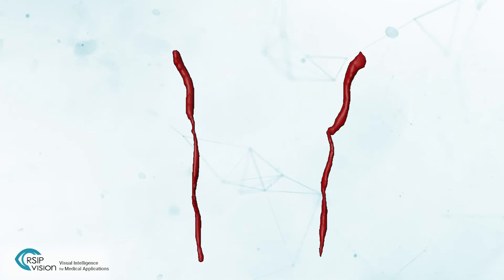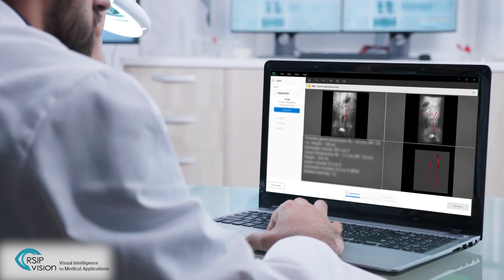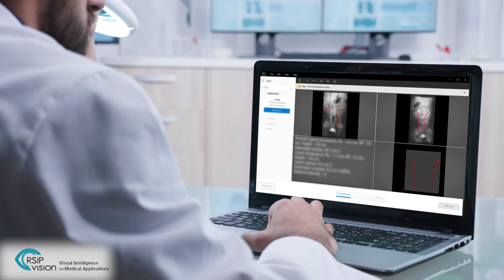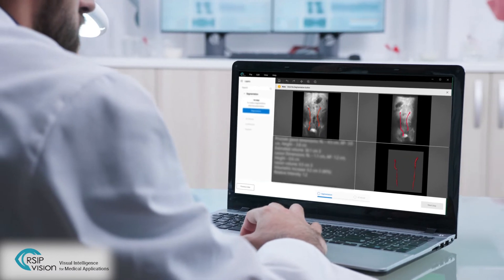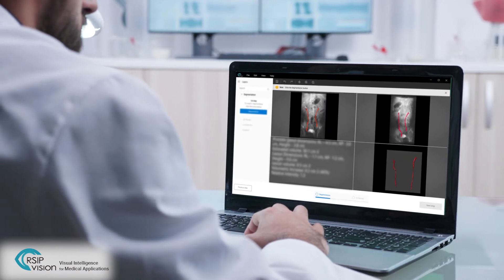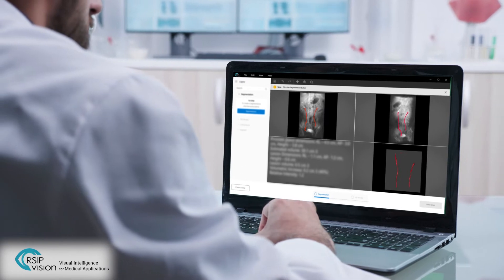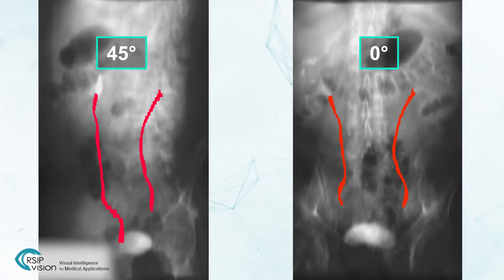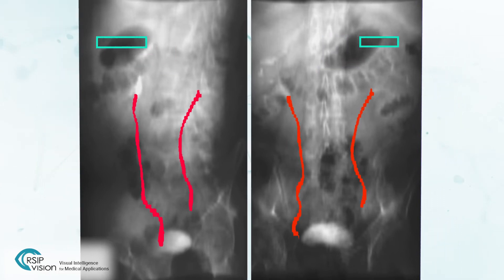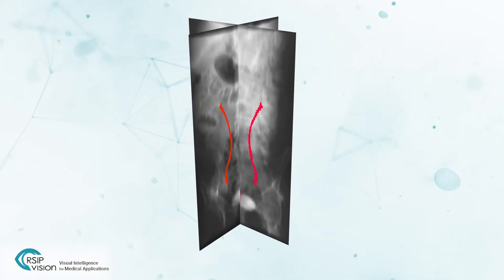RSIP Vision's new 2D to 3D reconstruction tool leverages AI technology to reconstruct an accurate 3D model of the ureter from two or more fluoroscopic projections. The ureter is automatically segmented, and the fluoroscopic image is calibrated.